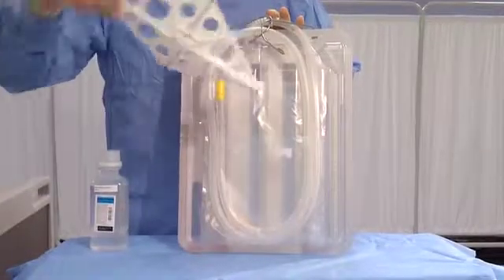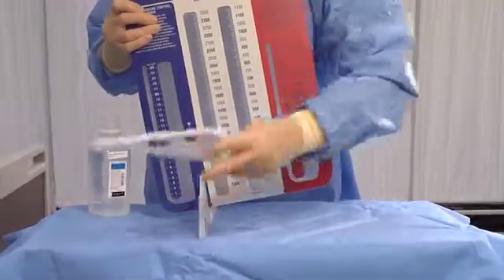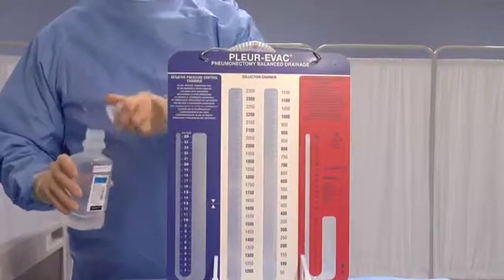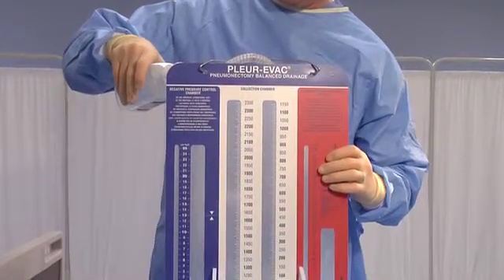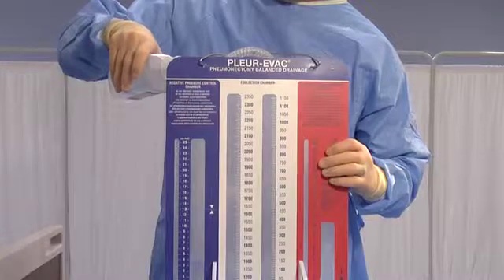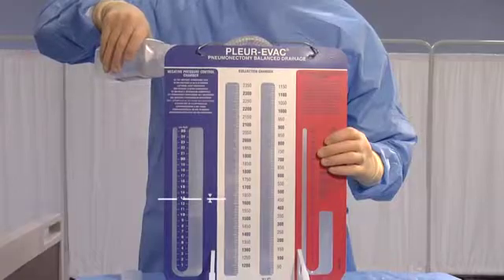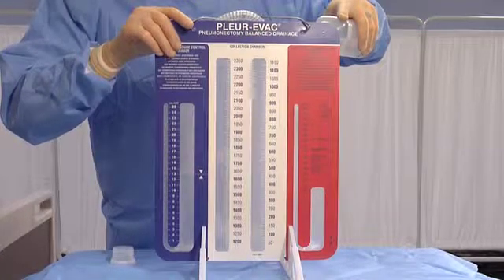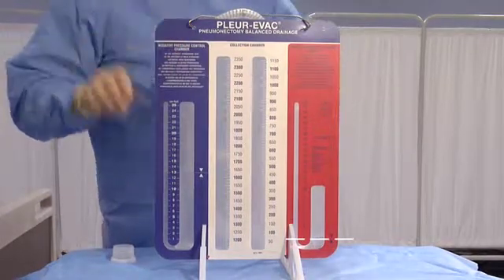Remove the two detachable white floor stand supports and insert one floor stand support firmly into place at each of the two locations at the bottom marked with a triangle. Prepare a 500 milliliter bottle of sterile saline or sterile water to fill the unit. Fill the blue negative pressure column through the atmospheric vent on top of the blue column to the prescribed height, usually minus 13 centimeters of water as indicated by the dotted line. Fill the red positive pressure column through the atmospheric vent on top of the red column to the prescribed level, usually one centimeter as indicated by the dotted line.